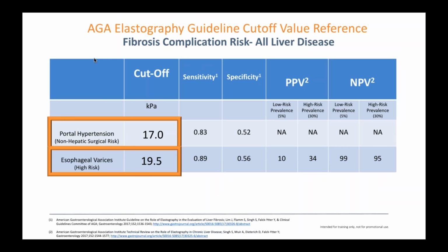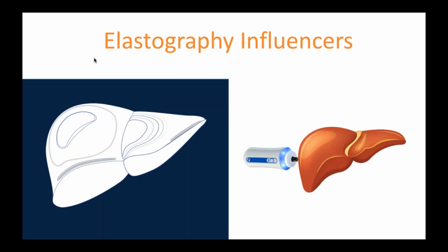Finally, please remember that the AGA elastography guidelines for portal hypertension and esophageal varices apply to all liver disease, so those would still be applicable when we're in NAFLD.